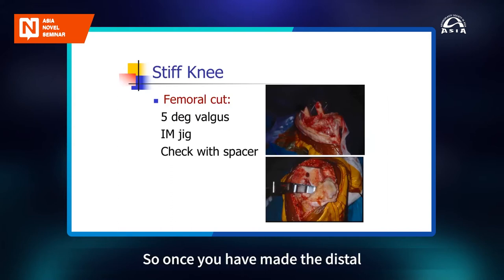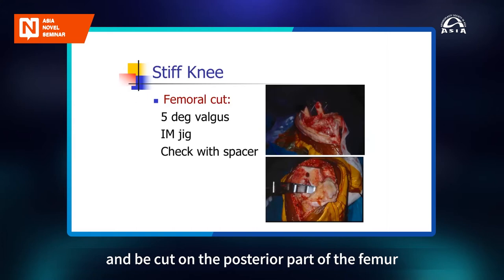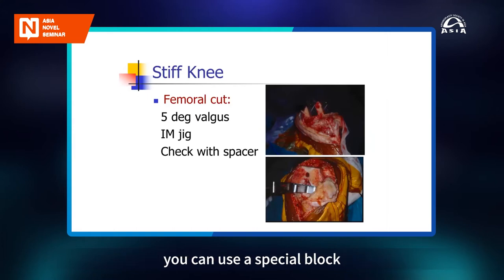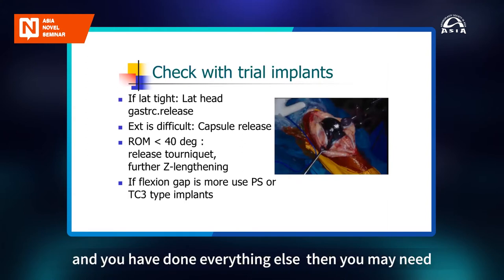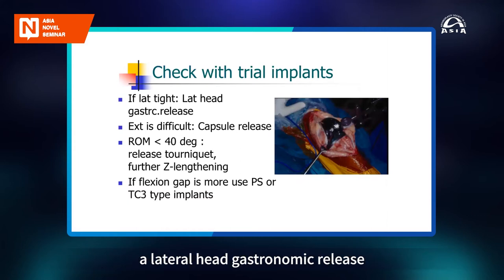So once you have made the distal cut and the cut on the posterior part of the femur, you can use a spacer block to see that you have got both the flexion and extension gaps okay. Now, when you put the trials in and you find you are tight laterally and you have done everything else, then you may need a lateral head gastrocnemius release, very rare nowadays.